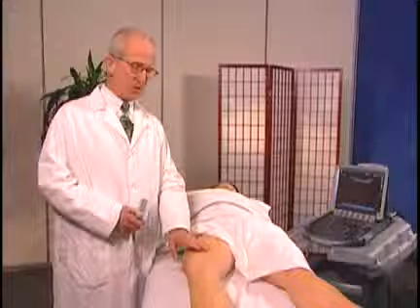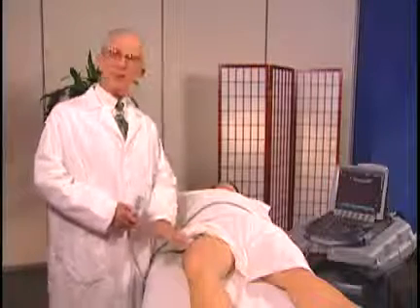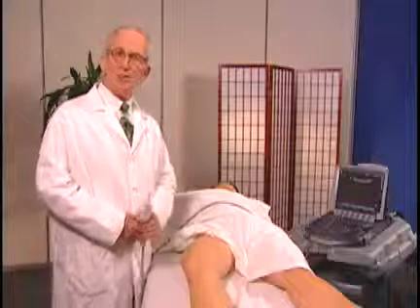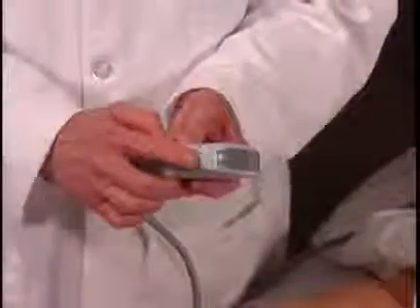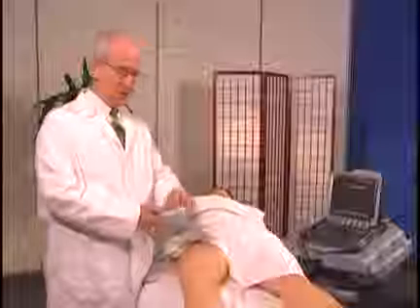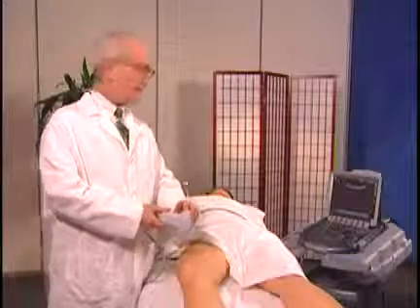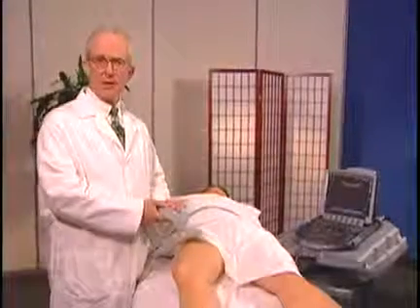Positioning is important. She's lying on her back with her leg extended and slightly externally rotated — this is the best position to see this joint. I've chosen a C60 transducer. There is a line here which corresponds to the turquoise dot on the screen, and this we usually by tradition keep proximally or medially, and that's the way I'll orient this image.